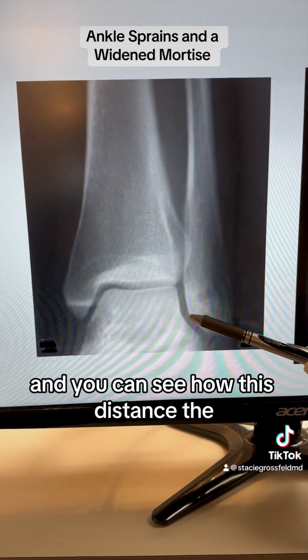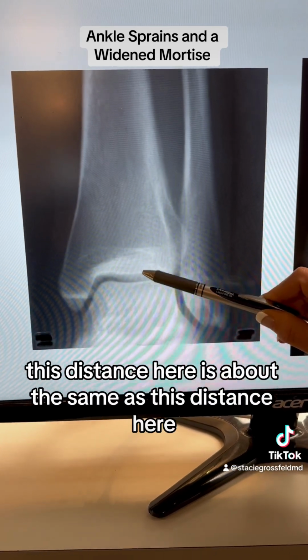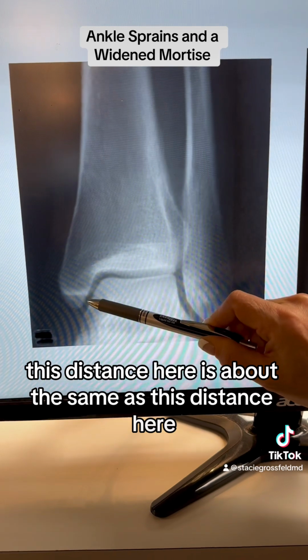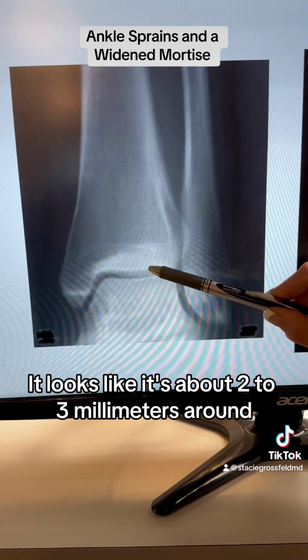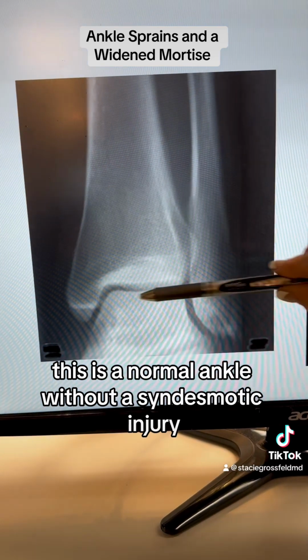And you can see how this distance, the dark area, is about the same as this distance here, is about the same as this distance here. It looks like it's about 2 to 3 millimeters around. This is a normal ankle without a syndesmotic injury.